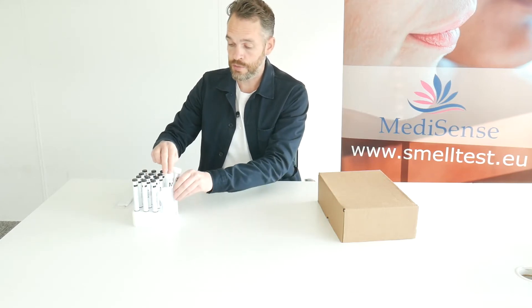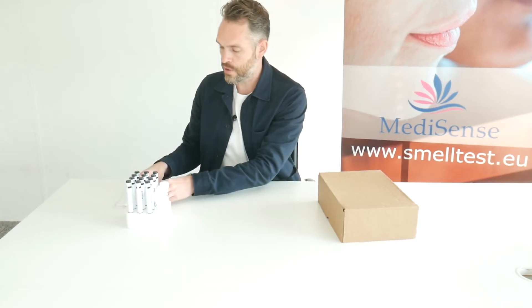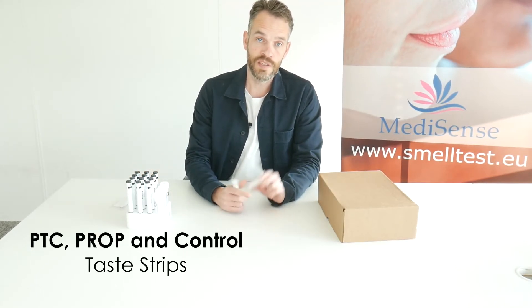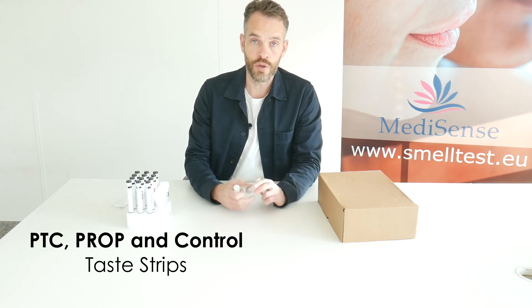Besides these taste strips from Burghardt, we can also deliver the taste strips from Sansonics, which are the PTC, Prop and Control taste strips.